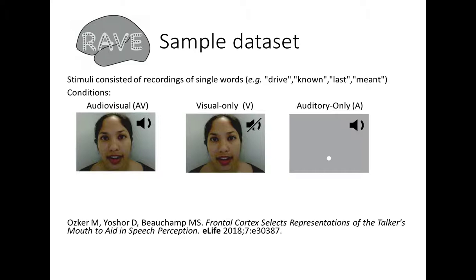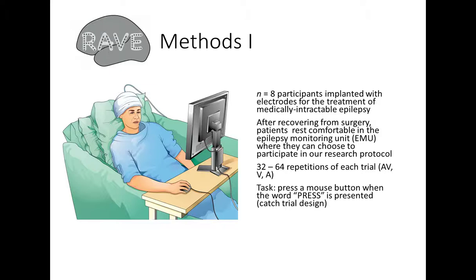So those are the 3 main conditions. And we went to St. Luke's Episcopal Hospital, where we worked with 8 different patients who had had electrodes implanted in their brains for the treatment of medically intractable epilepsy. After they recovered from the surgery, they rest comfortably in their hospital room.